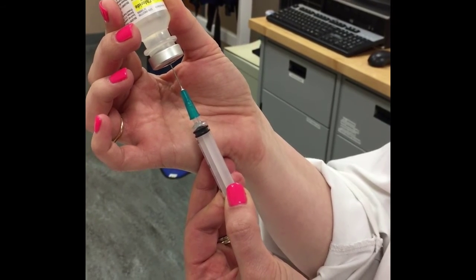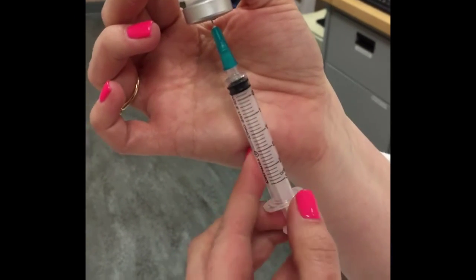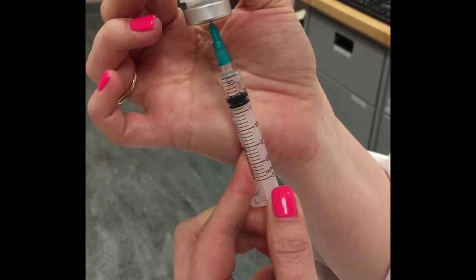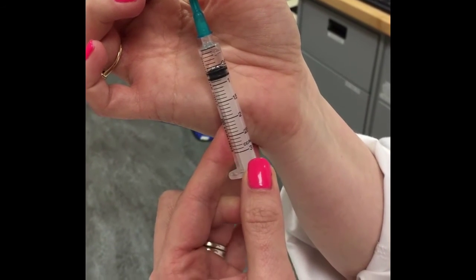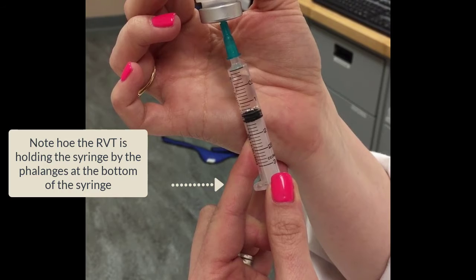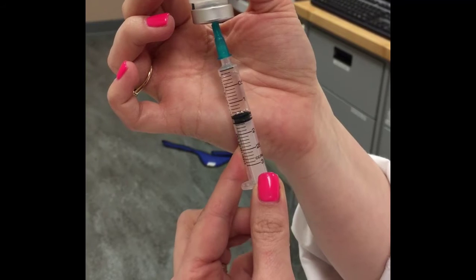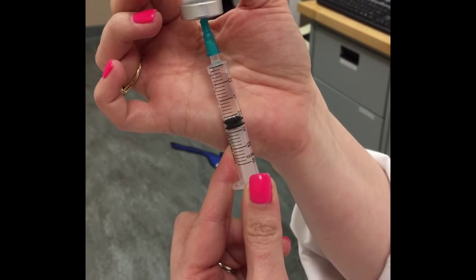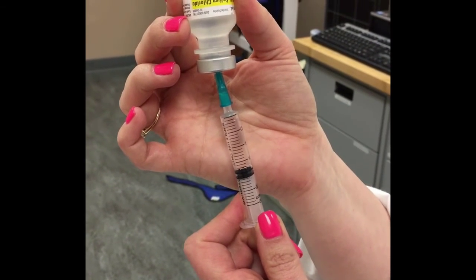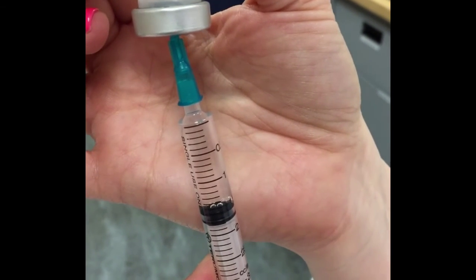I'm now going to insert my needle into the saline bottle. I'm going to draw up, I need 1.5 mils, so I'm drawing back on my plunger here with my middle finger, and it may vary. Each technician may use one finger, they may use 2 fingers to draw back on the plunger. So I'm going to draw back, and you can see that I am drawing back a little bit past the volume that I need. And then I'm going to advance the plunger to try and get rid of those air bubbles.